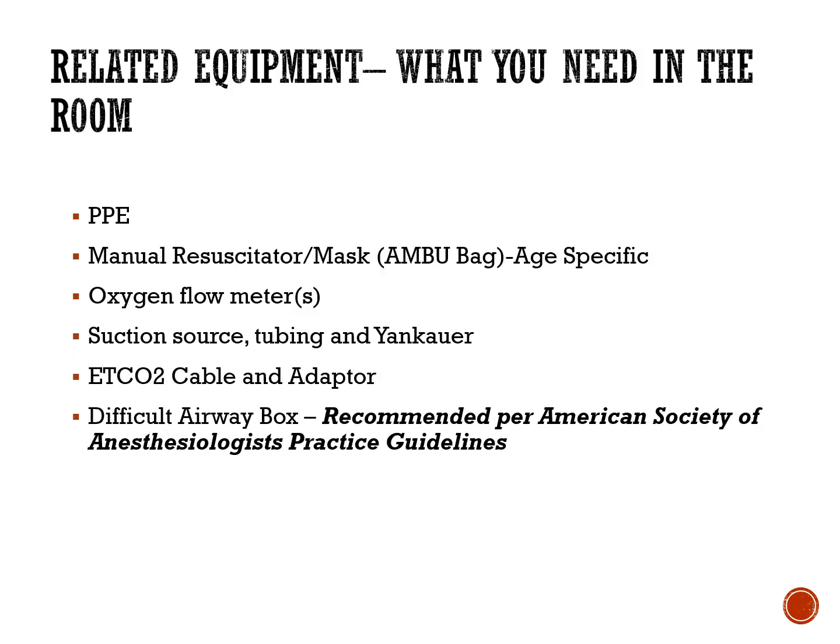Now let's examine the related equipment that you need. Before we get into the size tubes and laryngoscopes, let's talk about what you need in the room. And some of the neophyte intubators, or the newbie respiratory therapists who are assisting somebody else in intubating, can overlook some of this stuff. So PPE is your protective equipment. It's a good idea in the age of COVID and other communicable diseases to have an N95 on, or even a PAPR, some sort of a filtration device.